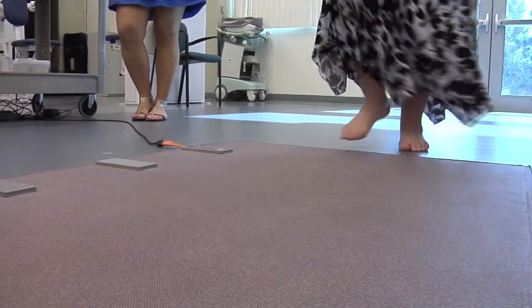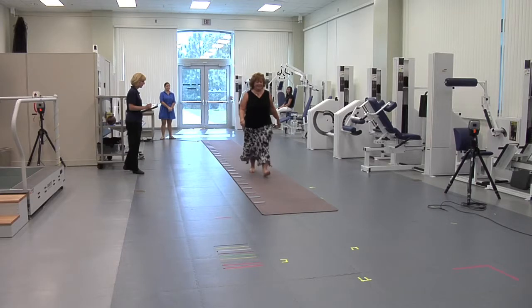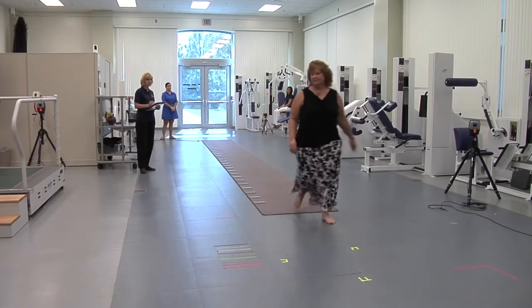it tells us a lot of information about how you move. Some things we're going to be able to get from this mat include how wide your steps are when you walk, how long your stride and step lengths are, how your feet turn out, and if your gait is symmetrical — so if your left side is operating the same way as your right side does.